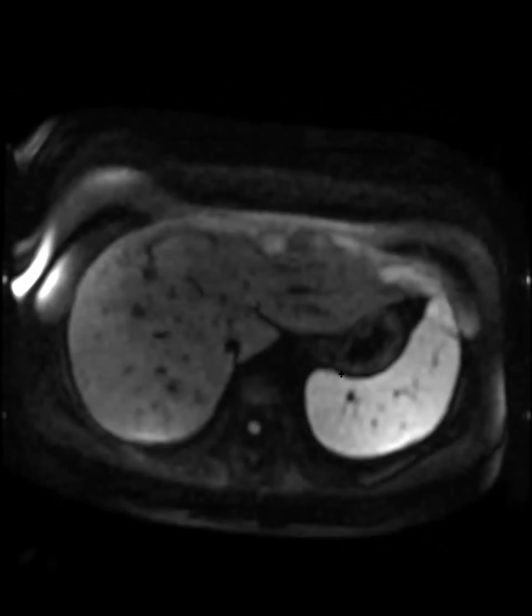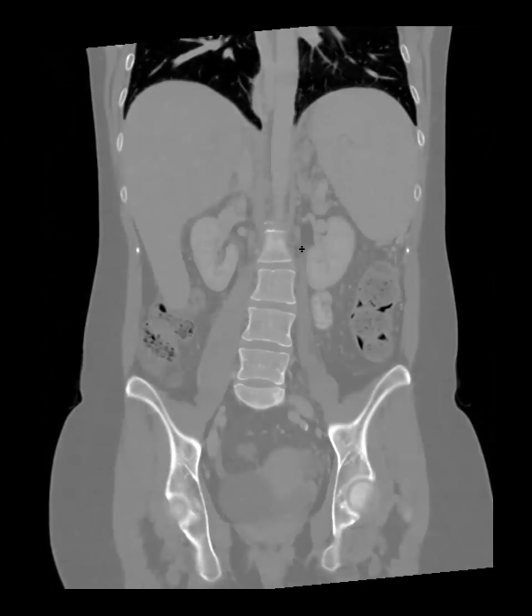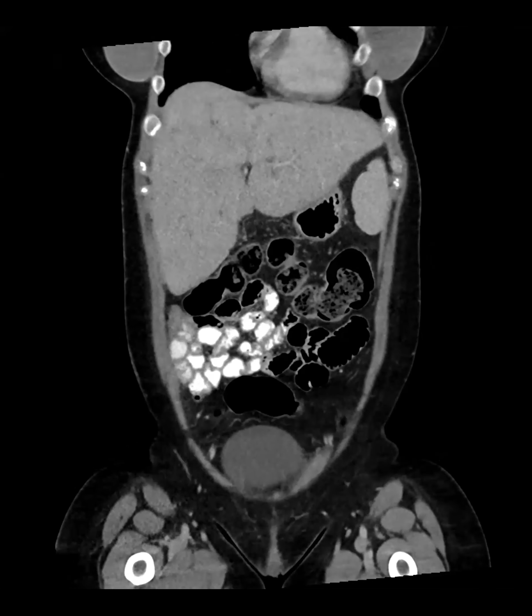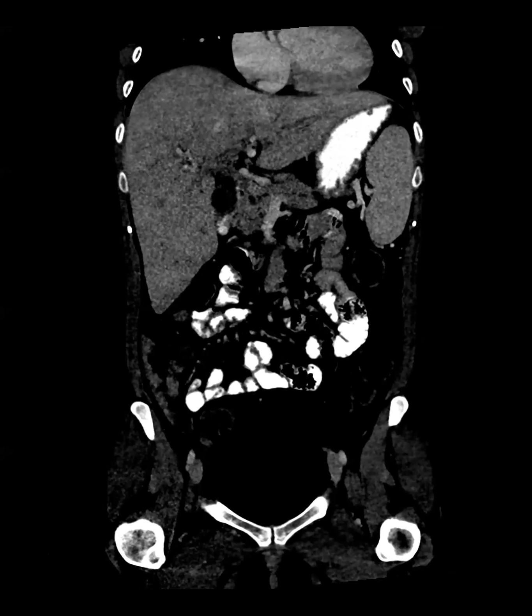Isn't it scary? And then we have a CT too before transplant, and same thing, nothing that I would call multifocal cholangio. Wow. I feel like more often we are worried about peribiliary thickening in patients with PSC, and they do lots and lots of brushings and it never comes back with malignancy, and then they're just stable over time. So I don't know what to take away from this. We do screening MRs all the time for PSC patients. This is like the second case where there was a cholangio that just wasn't really visible on MR.